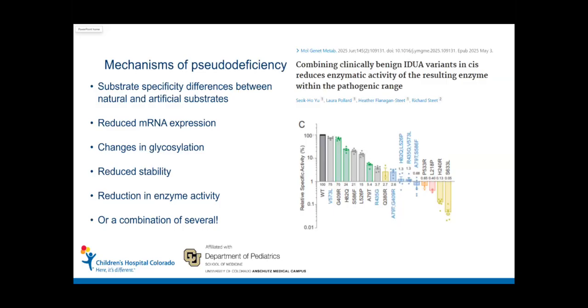to the range, or much closer to the range, of what you would see in a mild patient. So I think this is really important when we start looking at our genotype data, not just to look at the variants that were identified, the VUS or the pathogenic changes, but also are there any pseudodeficiencies in there? And one of the things that Jenny's group is wrestling with is a guideline for what to report, to make sure that the labs and the patient are communicating correctly about what genotype is actually there.